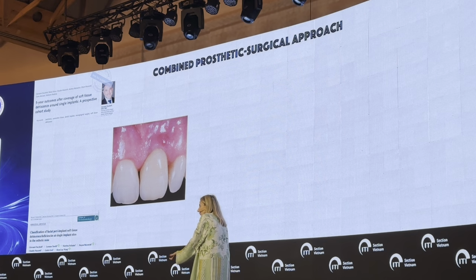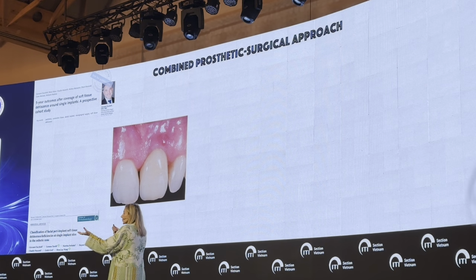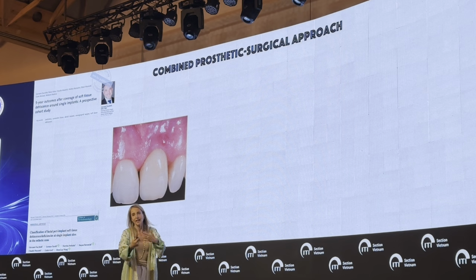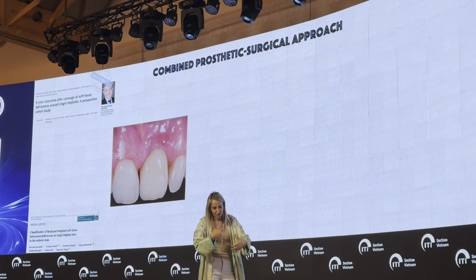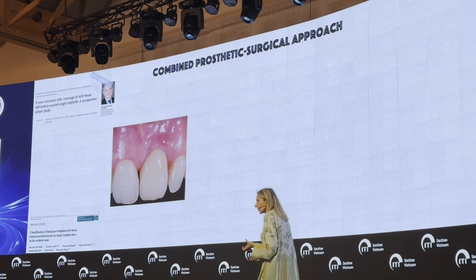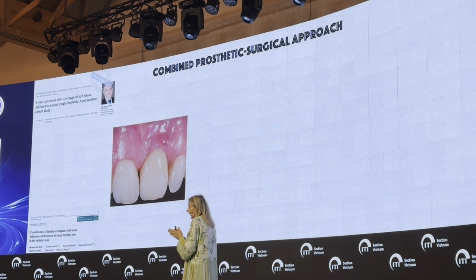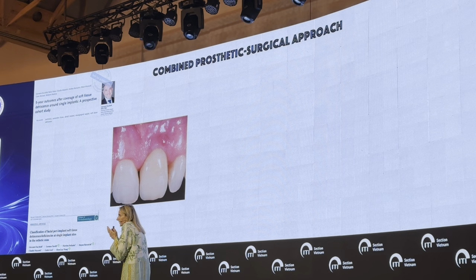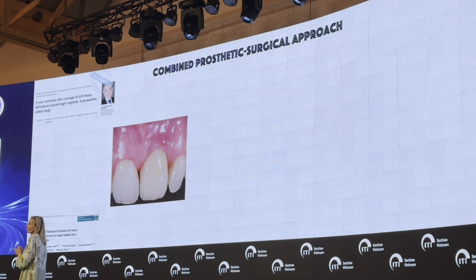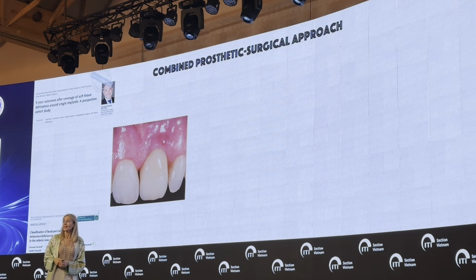And then, after 1 week, it came back and the soft tissue was even better. So we realized, and then we started to perfect this technique, that once you remove the crown and apply a narrower abutment and a short provisional crown, not in contact with the soft tissue, the tissue starts to grow and occupy the space that was previously occupied by the crown and the abutment.